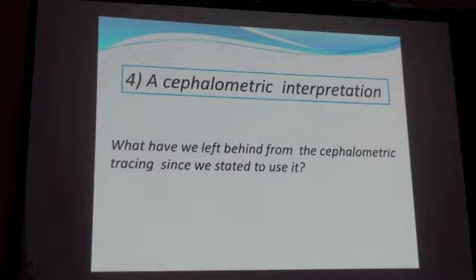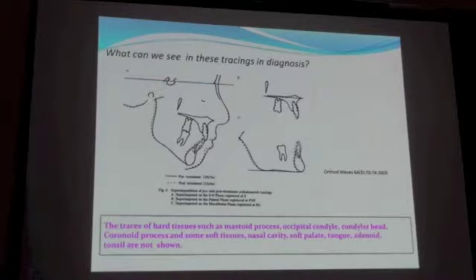The cephalometric interpretation. What have we left behind from the cephalometric tracing since we started to use it? I found this in the Japanese Orthodontic Society board case. And this is the cephalometric tracing presented to the board case.